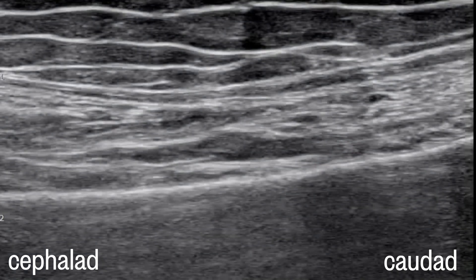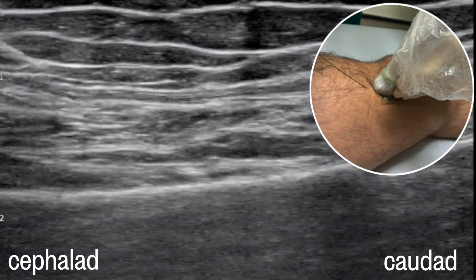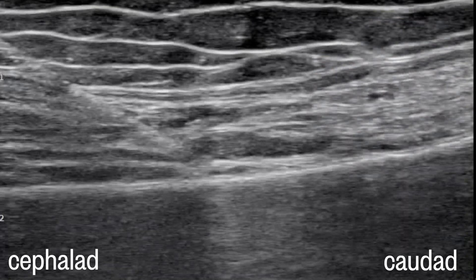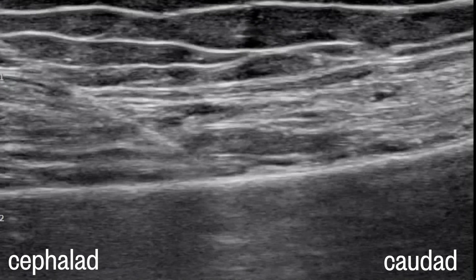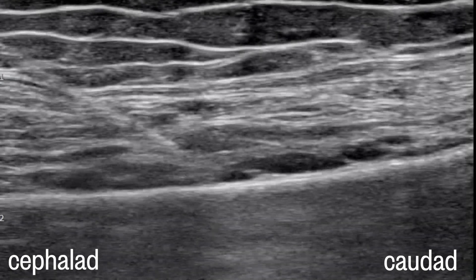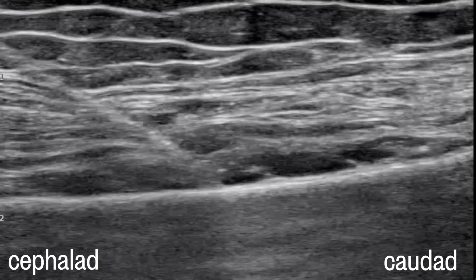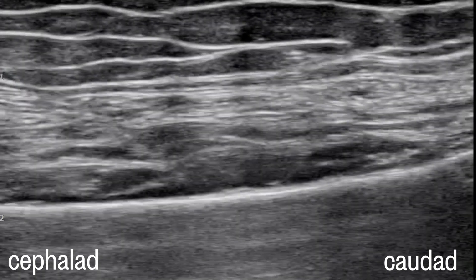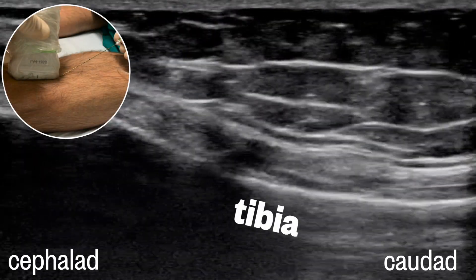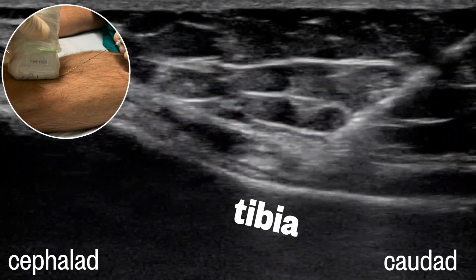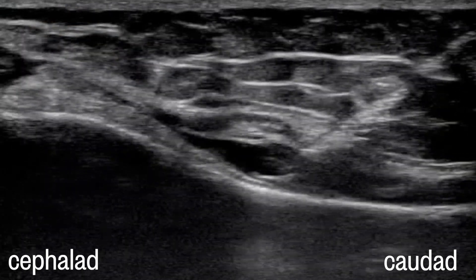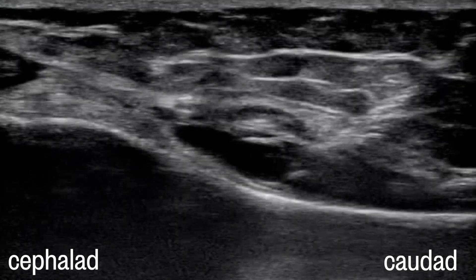The genicular nerves are quite small and for that reason we don't try to visualize them on ultrasound. Instead, the needle is directed to contact bone at the bottom of the slope in the general vicinity of the artery. Here's the needle passing through the muscle and tendon of vastus medialis. Five mils of local anesthetic easily lifts off the soft tissue and spreads along the periosteum. The approach for the two superior genicular nerves is identical and just a mirror image of each other. For the inferior medial nerve, the probe is on the anterior medial tibia and the genicular artery is usually easily seen. A needle is advanced from the caudal aspect until bony contact is felt, and then five mils of local anesthetic is deposited there.